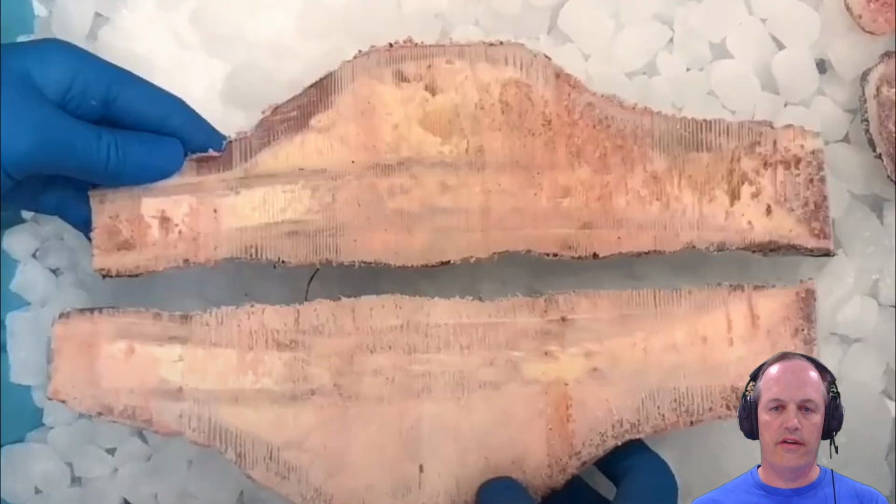So I said this was a diaphyseal bone tumor. Here's a really good picture. This is actually from a YouTube video I posted on grossing bone tumors. And what you can see here is this is a long bone. It's the central portion of the bone. The surgeon has cut the ends off to take this out. And you can see here's the cortical bone, and here's this large mix of tumor and periosteal reaction that's infiltrating through the center of the bone.